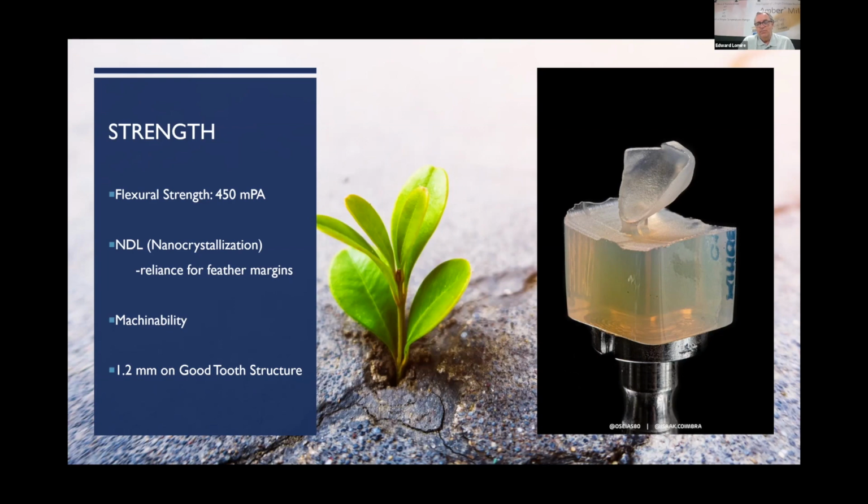So you can adjust your margin a little bit if you think you want a little bit more, but 1.5 seems to be a great number for us, as a maximum reduction. When you're doing the reduction, you also want to make sure that you don't have pointed sharp line angles, and that's pretty much true, I think, with most restorations. But you know, smooth those down a little bit, and you're good to go.